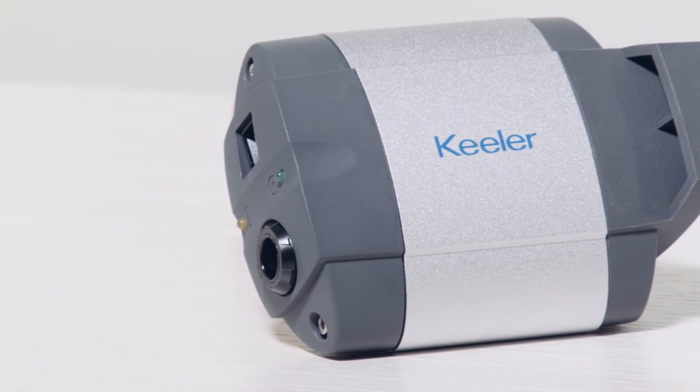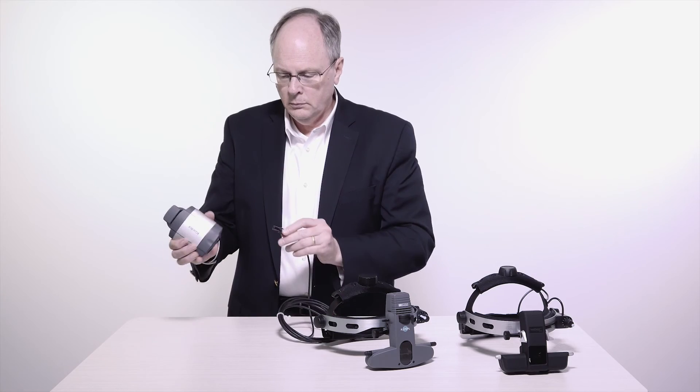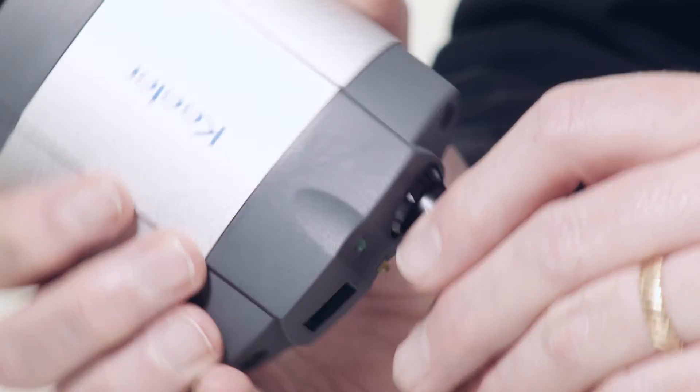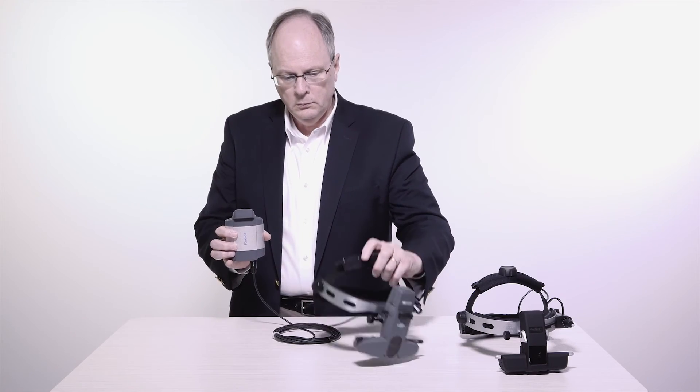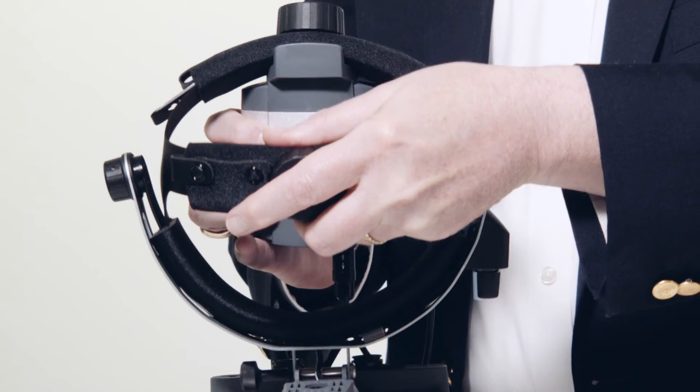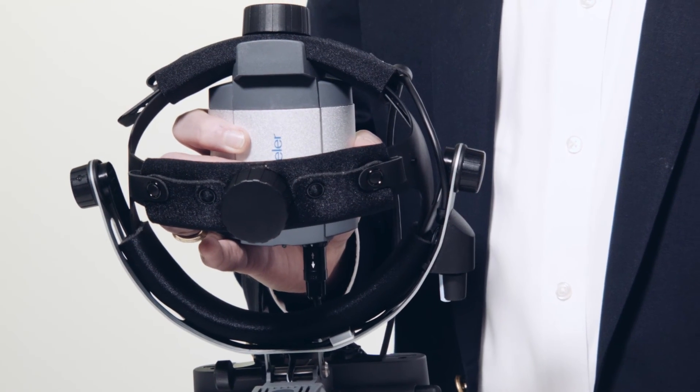All Pupil 2 or Vantage Plus wired units can be powered using the wall-mounted wall pack. This compact control and power system can neatly store and power your indirect. The built-in microswitch conveniently turns off the system when placed into its cradle.